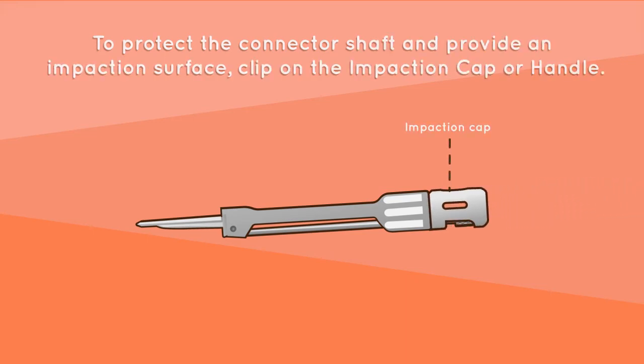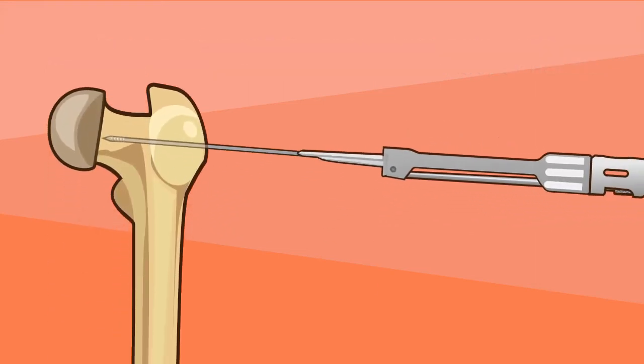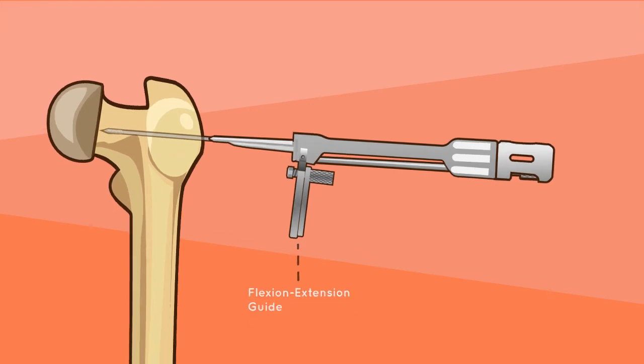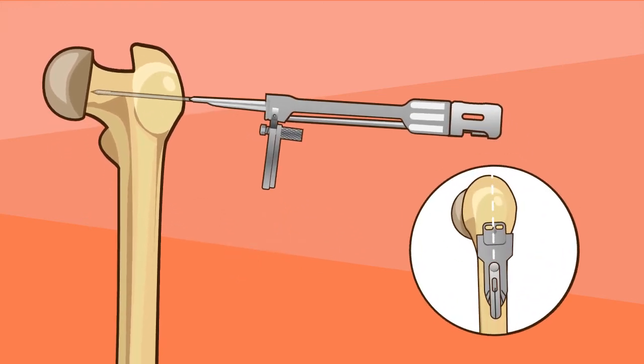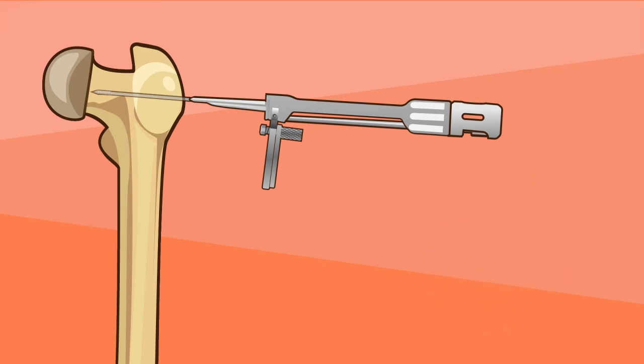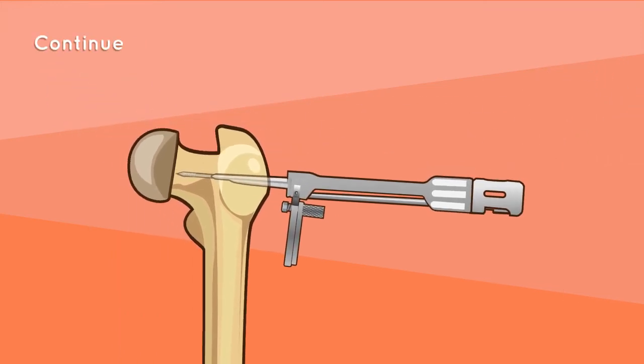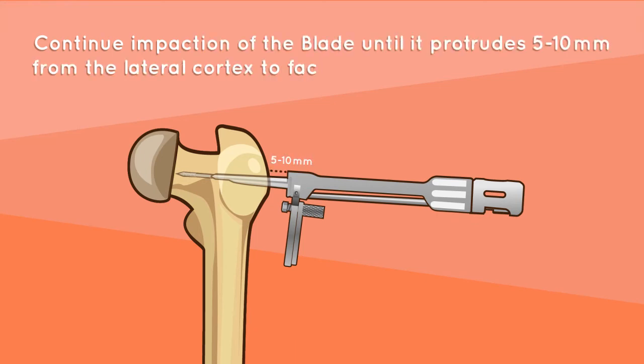To protect the connector shaft and provide an impaction surface, clip on the impaction cap or handle. Slide the blade and joystick assembly over the guide wire up to the lateral cortex. Clip the flexion-extension guide onto the joystick to confirm the orientation of the blade before insertion. Place the dial of the flexion-extension guide to the desired correction angle. Drive the blade by impacting the back end of the impaction cap or handle with a standard mallet. Continue impaction of the blade until it protrudes 5 to 10 millimeters from the lateral cortex to facilitate assembly with the plate.